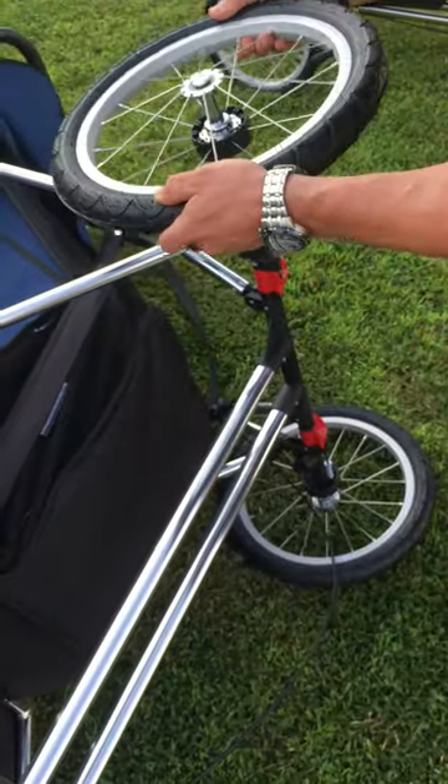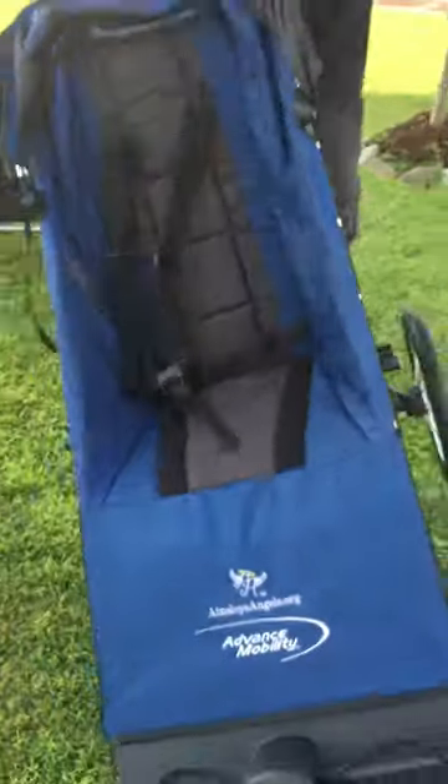Take this bad boy, put him right here, slam him home, and we are ready to race.